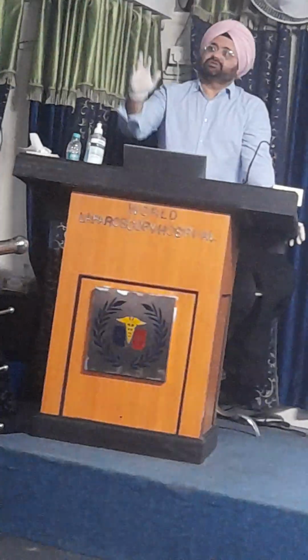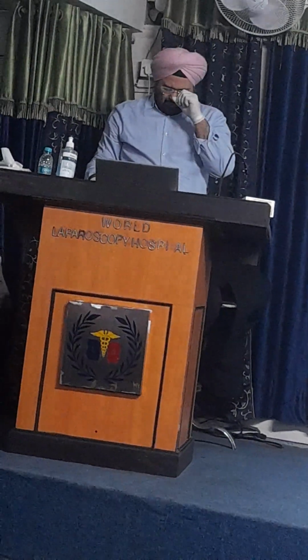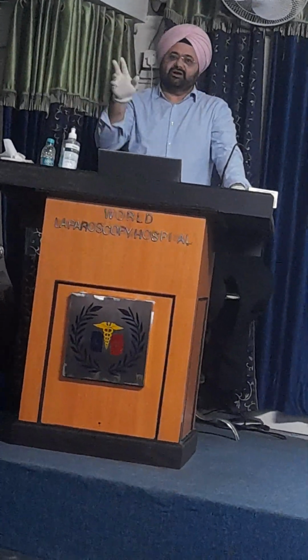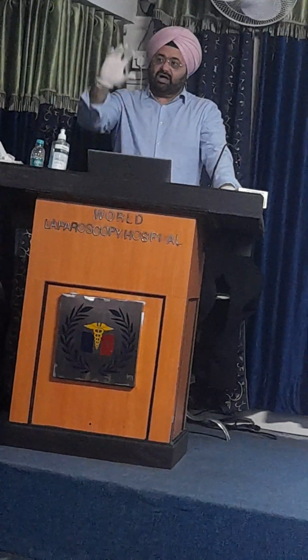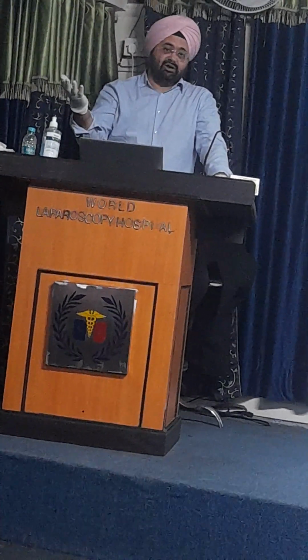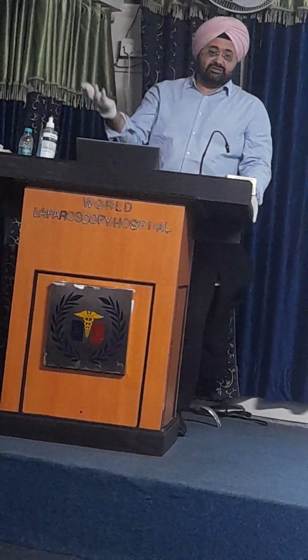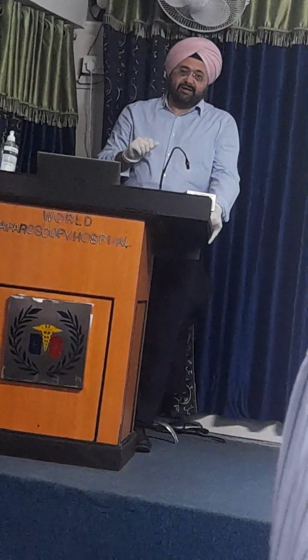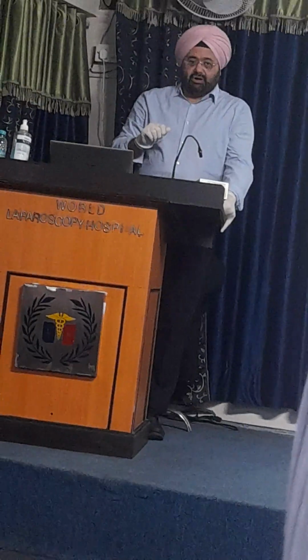First of all, you see the image on the screen. It is difficult to do a procedure otherwise, isn't it? Having a large monitor in front of you is much easier. It will give you a large view, and the resolution goes up because the pixels are high. If you have a very high-end system, which you are having nowadays, it gives you very crystal clear detail. The resolution is very high. So all these things are possible.